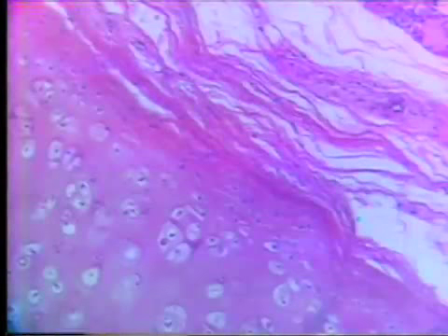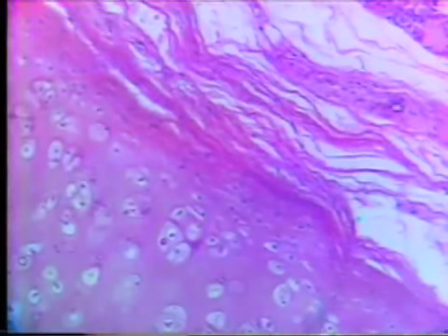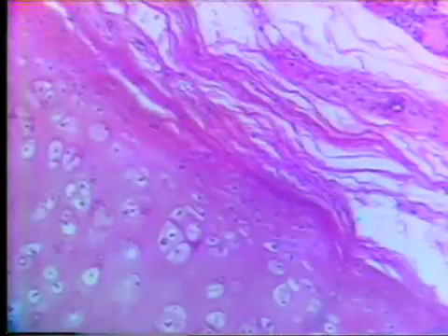Now an example of appositional growth, let's go to the periphery here. There's some artifact there. Now here we see the perichondrium, and this growth is applied to the outside. These cells multiply and divide, differentiate from the fibroblasts in the perichondrium, and this accounts for the appositional type of growth of cartilage. So with cartilage we can have two kinds of growth. We can have growth from within, which is interstitial growth, or we can have growth applied to the outside, appositional growth.